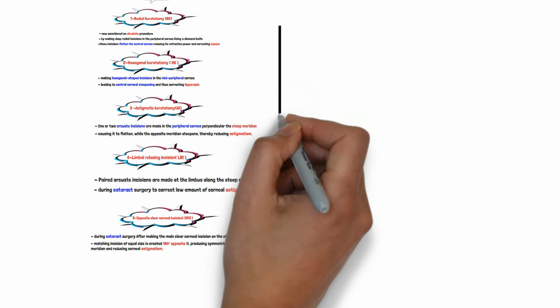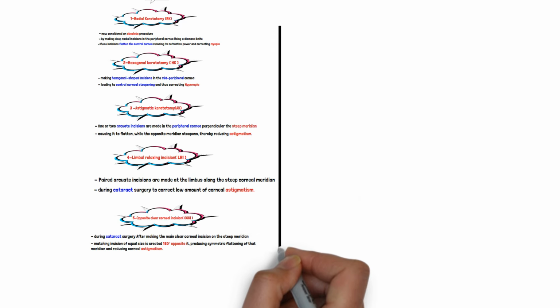While these incisional approaches laid the foundation for modern refractive surgery, the development of laser systems soon revolutionized the field, introducing precision, predictability, and safety. 2. Surface procedures.